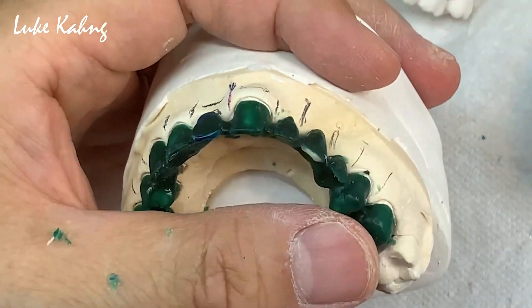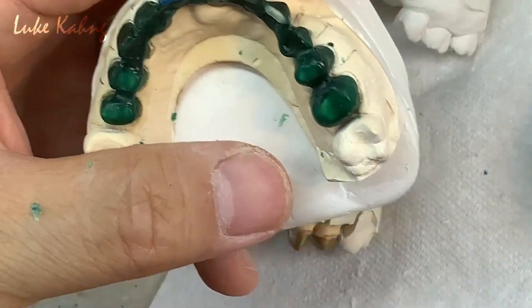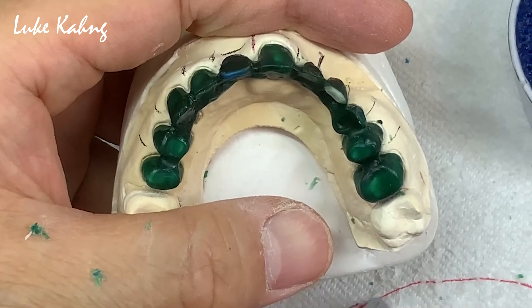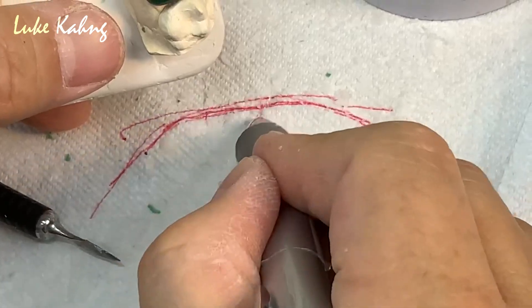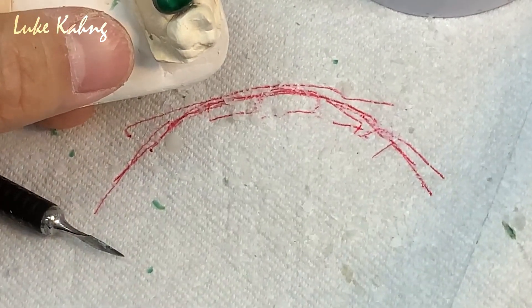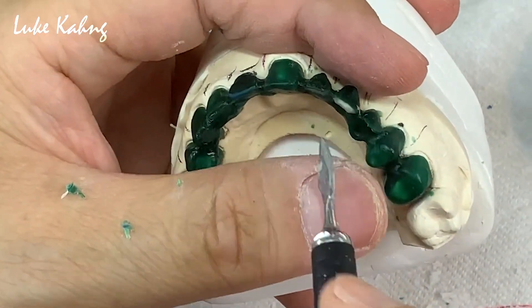Now remember, I have to set the length compared to what I measured — 8 and 9 same length. Also you have to see the alignment. What do you mean alignment? Alignment is occlusion — occlusion harmony from the occlusion view. Central, lateral, canine — I like this.